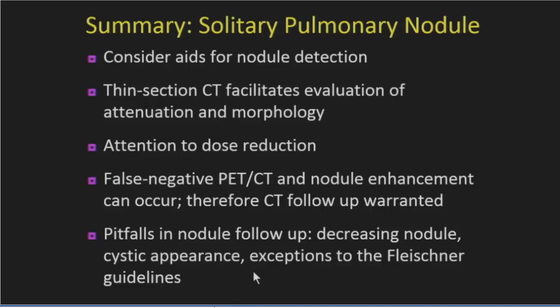And false negatives do occur with PET-CT and nodule enhancement if that's utilized, and therefore follow-up CT of negative nodules by those modalities is recommended to avoid misdiagnosing cancer as a benign entity. And to keep in mind the decreasing nodule, to continue following those lesions to long-term stability or resolution, and that there are cystic presentations, and there are exceptions to Fleischner guidelines.